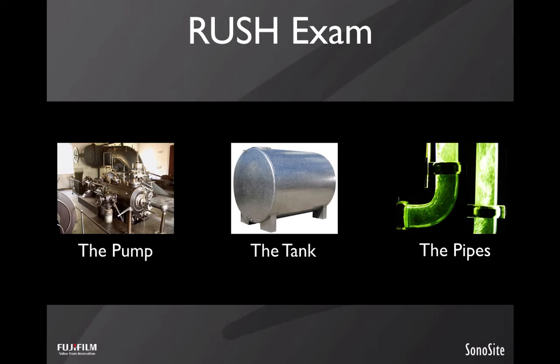How can you predict if this will happen in your patient? Well, you could always give a fluid challenge and see how the patient responds. But there's evidence showing that over-resuscitation can be just as dangerous as under-resuscitation, so it is important to be accurate and do no harm.